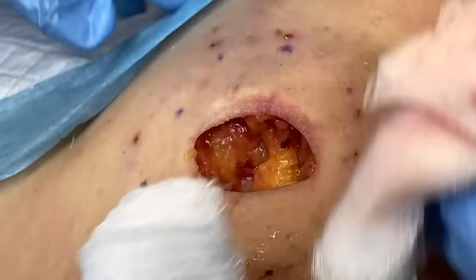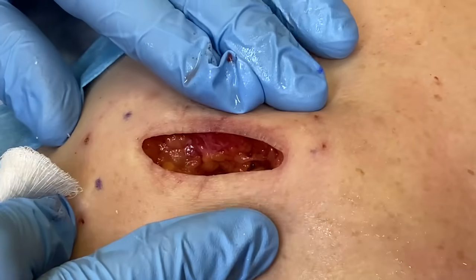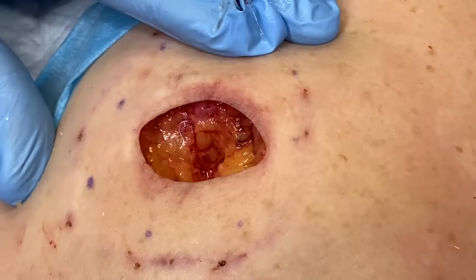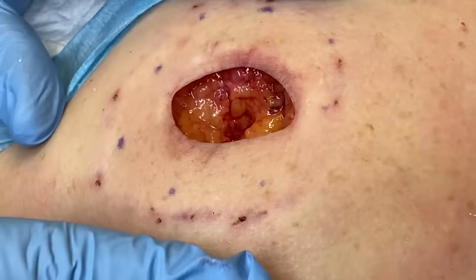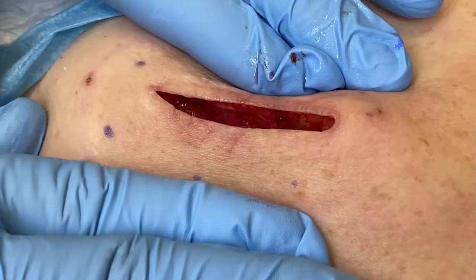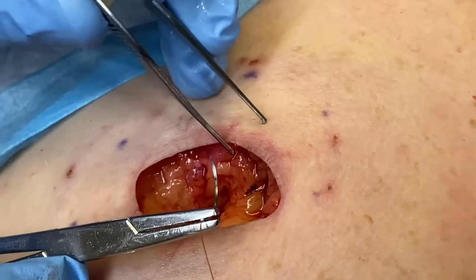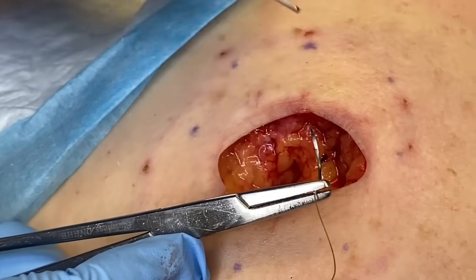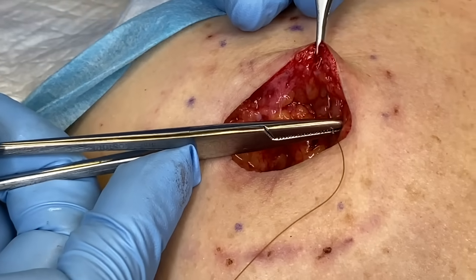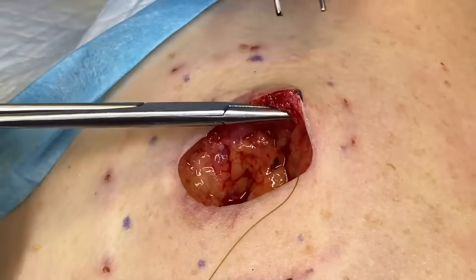And then it's definitely dermal sutures, right? Yes, for sure. So we just want to take a look at this and see that it's pretty clean. You can see here, especially when you appreciate after the fact how big that was, that if we hadn't taken skin out, you'd have redundant skin overlapping. For this one you need your Adson pickup, so you have the teeth on it. You're going super deep to superficial. The closer I am to the dermal epidermal junction, the tighter the stitch will be.